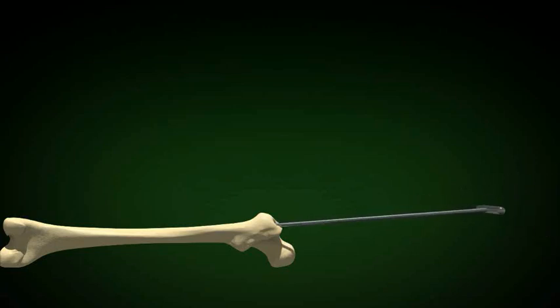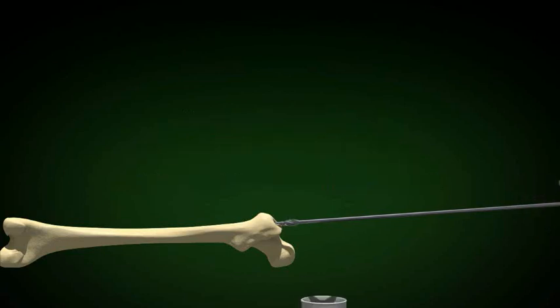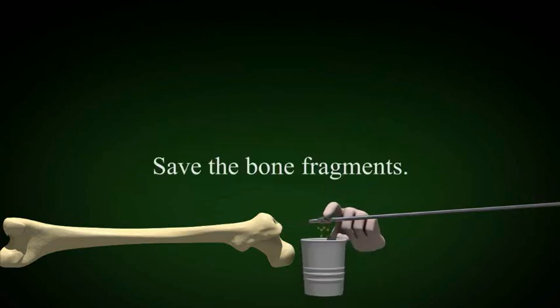This is the blunt nose reamer which can follow the tract. Ream until chatter about 4 cm in the isthmus. Choose a nail 2 mm smaller than the reamer that caused that chatter.